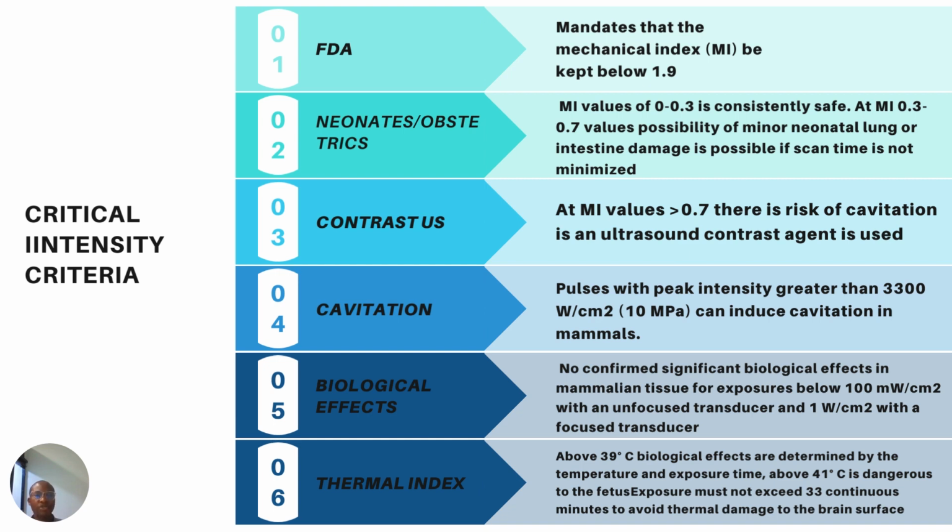I encourage you to watch your MI values and TI values and make sure that you reduce your scan time, because there is possibility of minor neonatal lung or intestinal damage if your scan time is not minimized. So we wouldn't want that to happen. So if you don't want that to happen, you have to keep your scan time short.